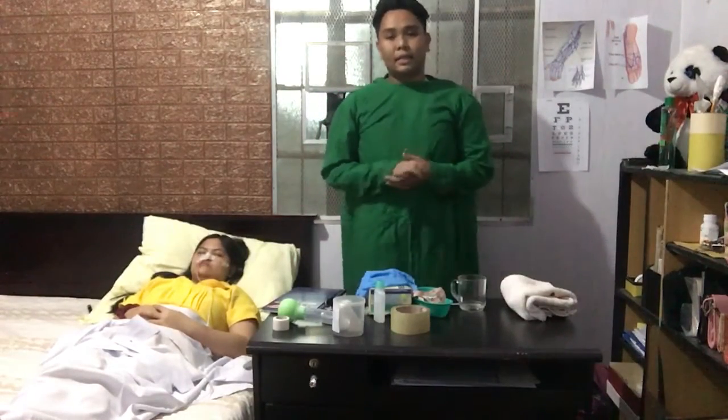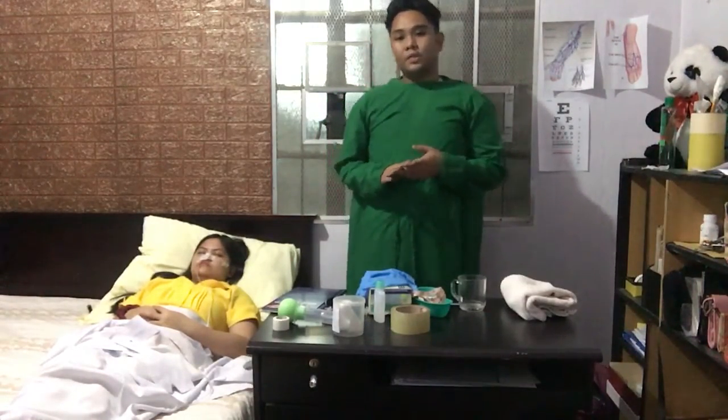Then, after po na maisuot natin yung PPE natin, is identify natin yung patient po natin.